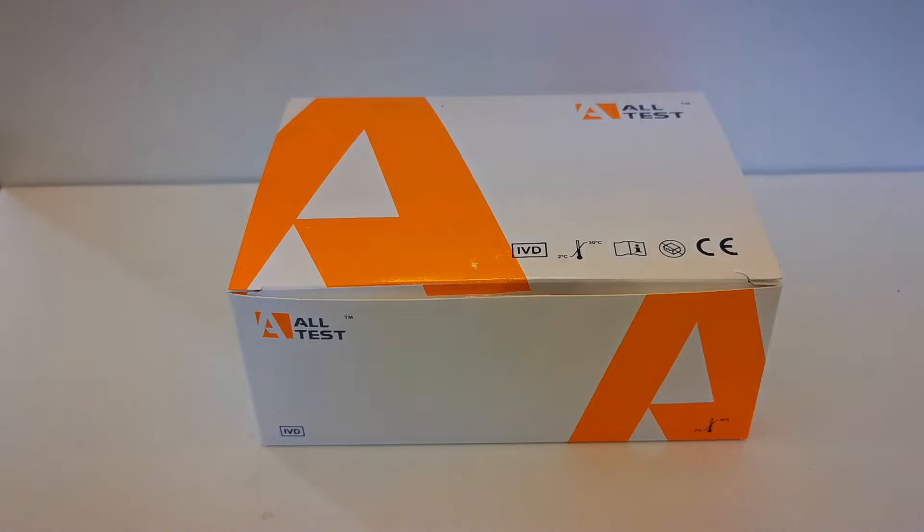Welcome to this joint UK Drug Testing and Valumed presentation video of the new gamma-hydroxybutyrate GHB urine test kit.